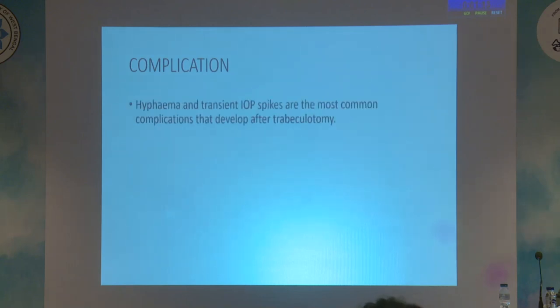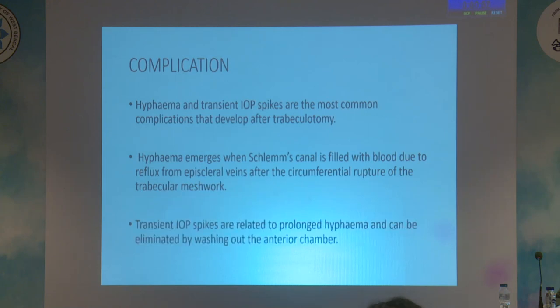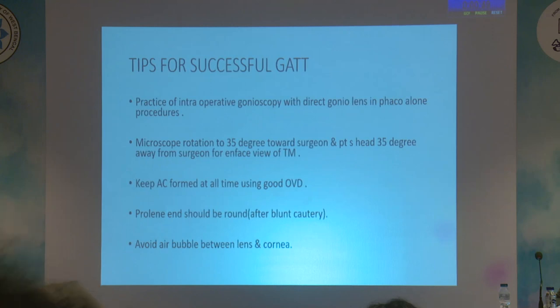The most common complications following a GATT procedure are hyphema and transient intraocular pressure spikes. The hyphema occurs when Schlemm's canal is filled with blood due to the reflux from the episcleral veins after the circumferential rupture of the trabecular meshwork. The transient IOP spikes are related to prolonged hyphema and can be eliminated by washing out the anterior chamber.